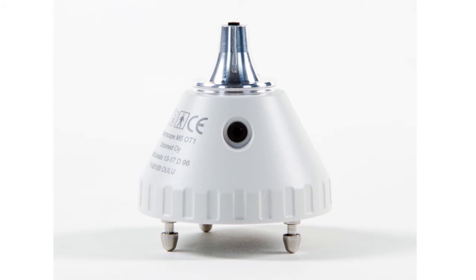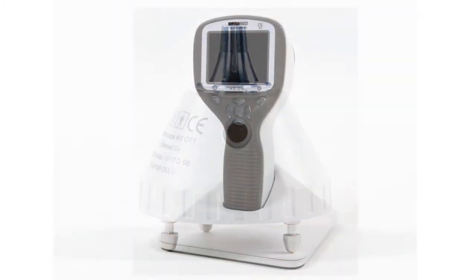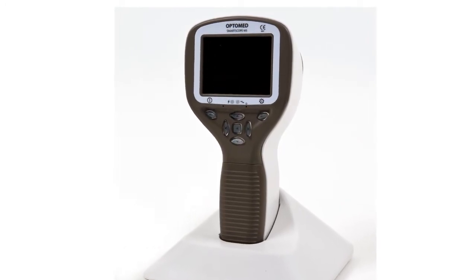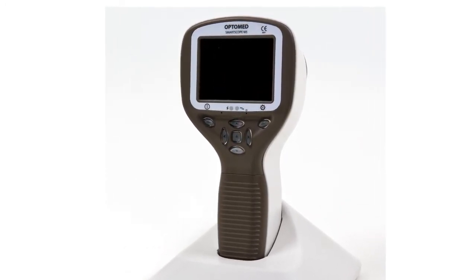Optomed SmartScope M5-OT1 is a digital otoscopic camera that enables examining the inner ear canal and tympanic membrane and documenting patient data through digital images and video.